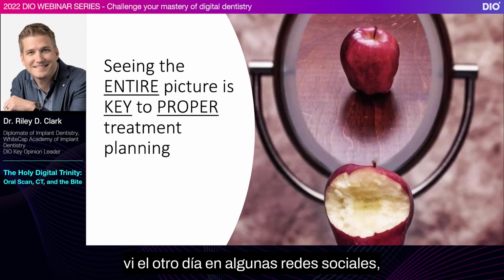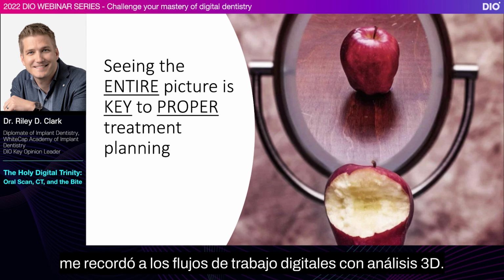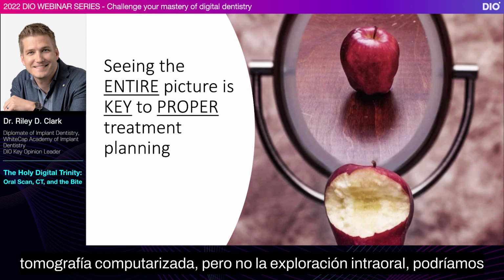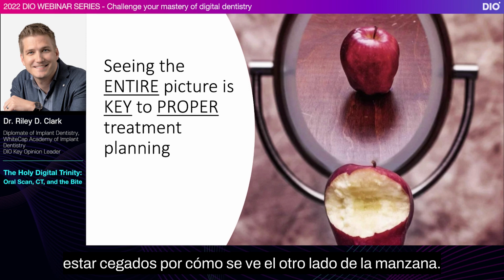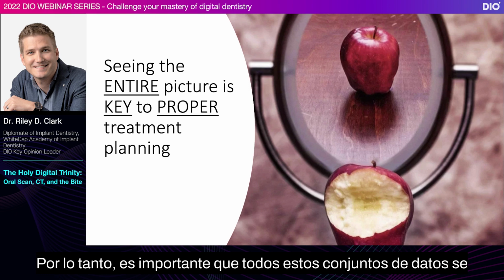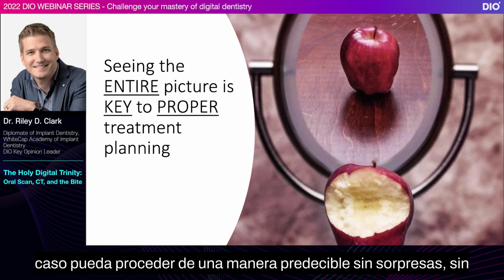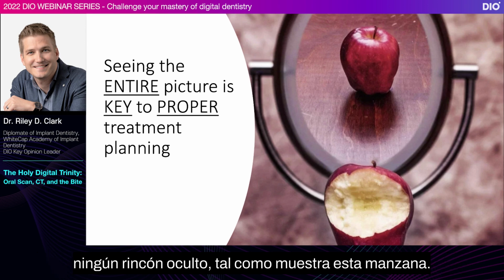Just like this picture that I saw the other day on social media, it reminded me of digital workflows with 3D analysis. If we only have, let's say, one side of the apple to look at, like the CT scan, but not the intraoral scan, we might be blinded by what the other side of the apple looks like. So it's important that all of these data sets are obtained and accurately referenced to one another so that our case can proceed in a predictable fashion without any surprises, without any hidden corner, just like this apple shows.